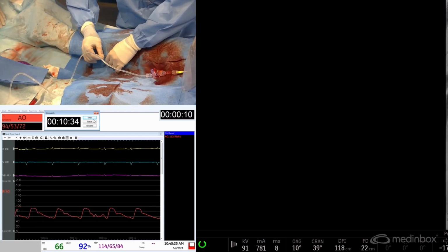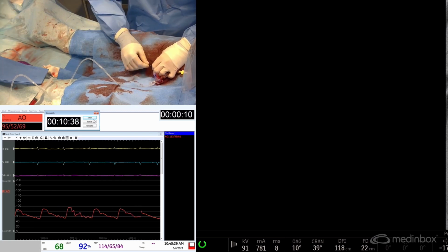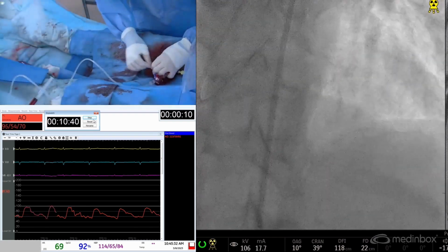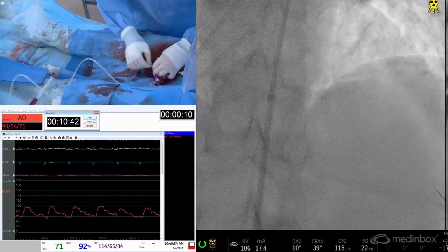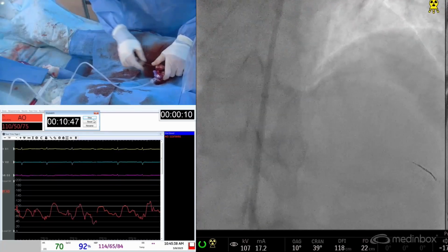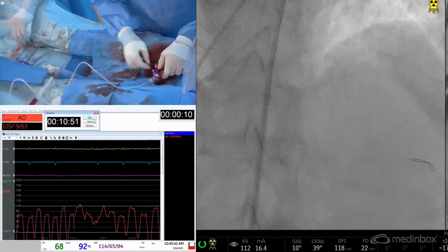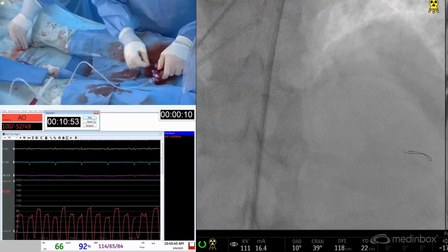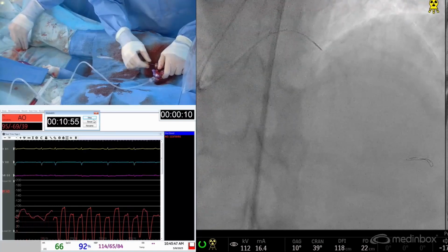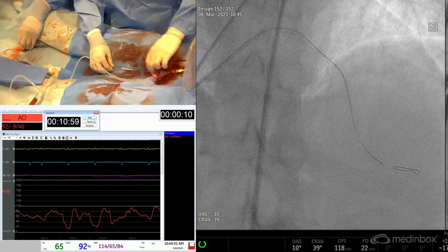We're just going to get our microcatheter in, and then we'll take a cine to assess after. Pull back. Le BH, t'as pas besoin. Pull back on the wire. Yep. Doucement. Ouais. Encore. So as you saw, very smoothly.